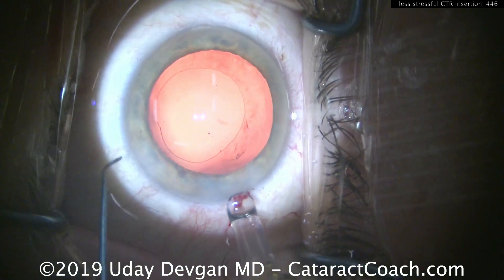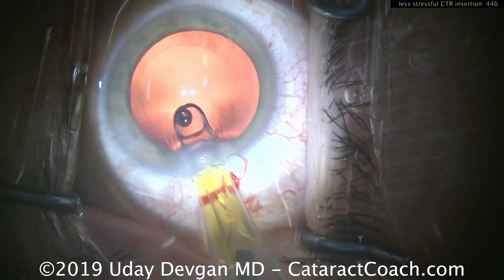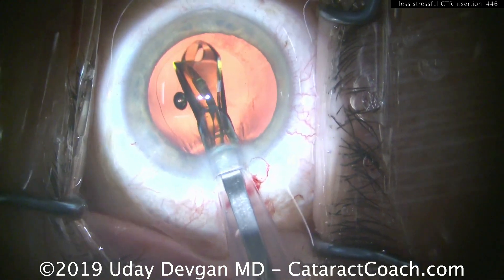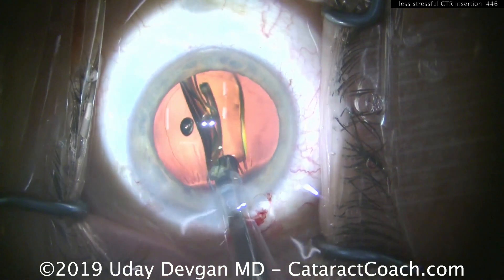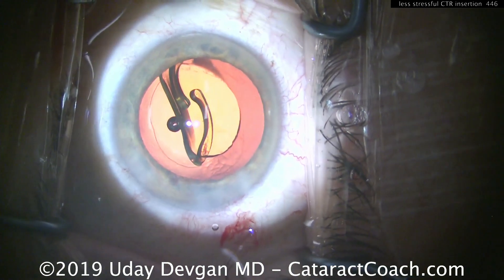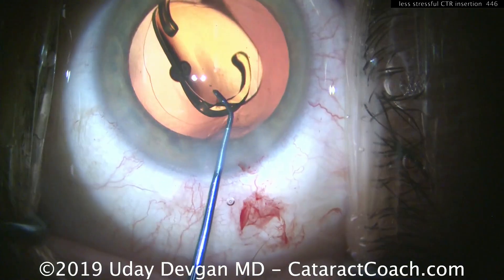That CTR tip is held by the Sinski, allowing it to be inserted further into the eye. You can get a larger portion of it within the anterior segment prior to releasing it and touching the capsular bag equator. Here's the traditional type of insertion — now we put the lens in and the rest of the case goes smoothly.